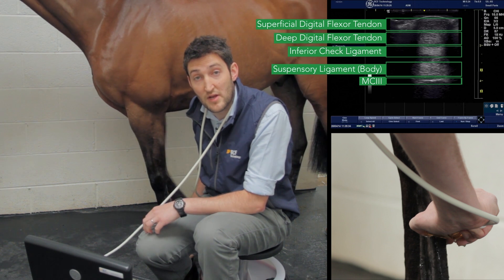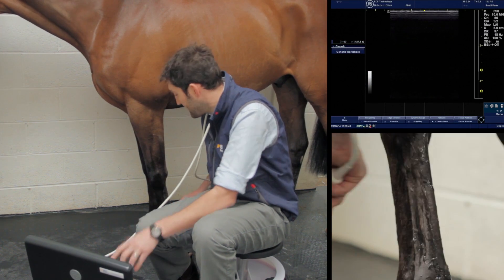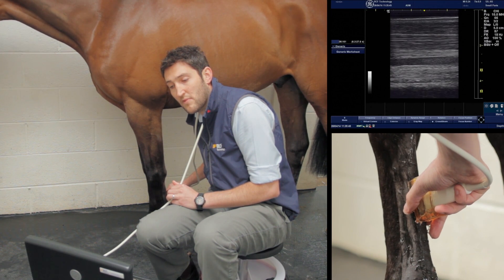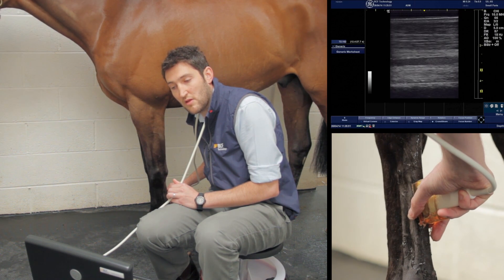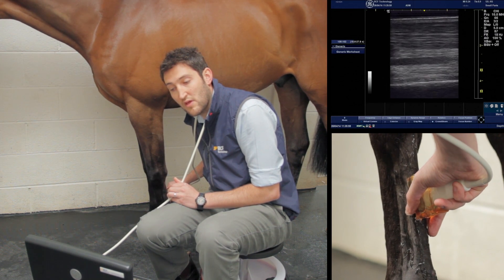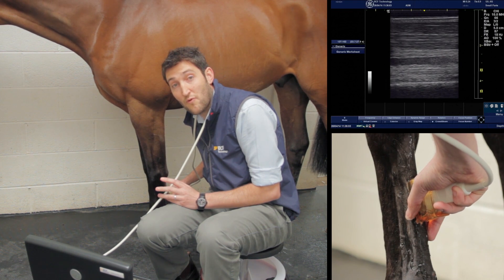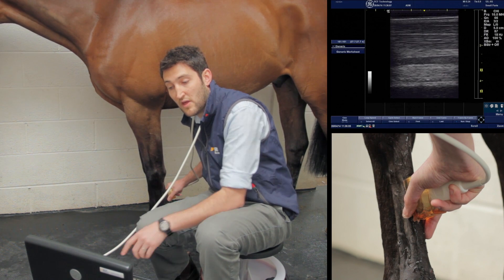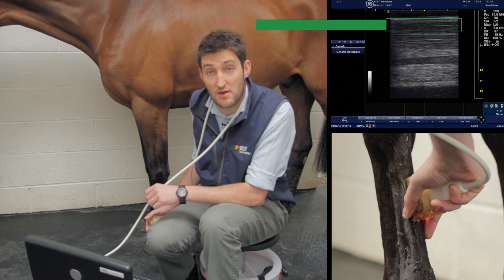We can also take the longitudinal image. The width of the linear probe is roughly the width of zones 2a and 2b together — just slightly short of that — so we probably only need one or perhaps two stills in longitudinal section through zone 2. As before, we align the fibers so they're nice and horizontal, then freeze the image.